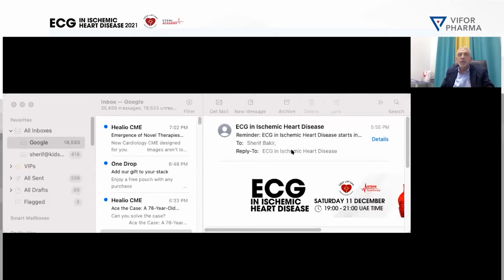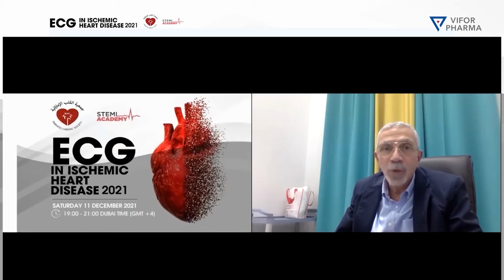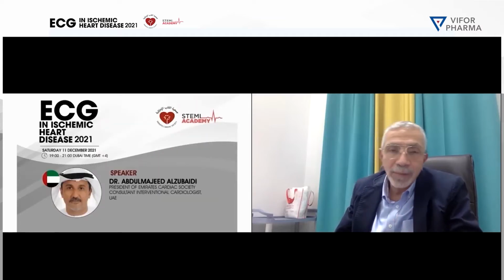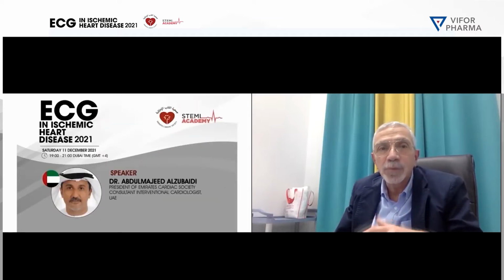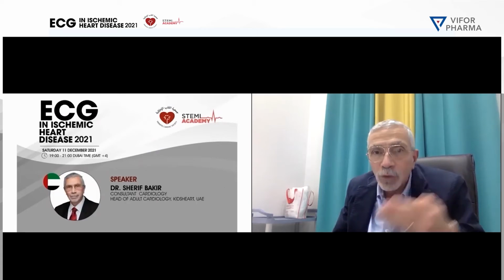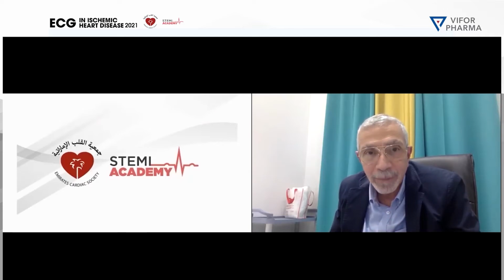For all of us to understand the ECG and have an idea how to interpret it, it is very important that you put a scheme in your mind. It means that your brain interprets the ECG automatically based on the scheme you have put in your mind. For any test, why do you need the test? Simply because the test will give me the diagnosis, and the same test can give me the prognosis, but it is also important for follow-up.